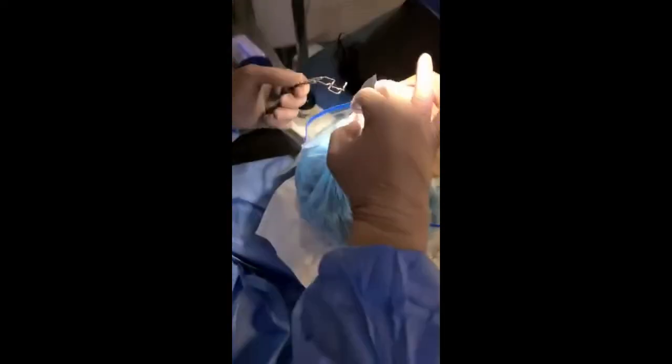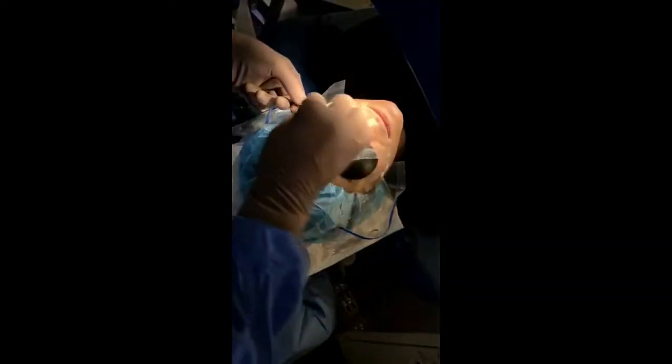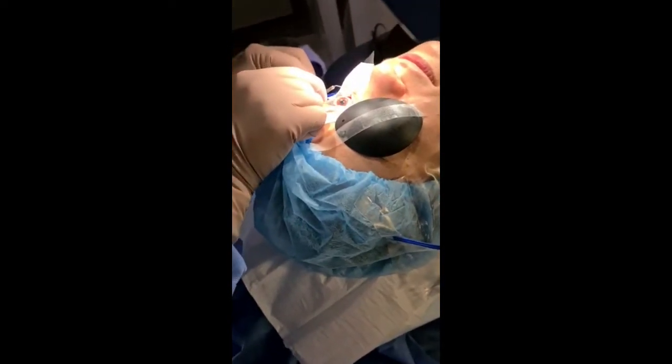Tight feeling on your eye now. I'm going to open your eyes a little with the speculum. It's going to feel a little bit tight. Not too tight I hope?